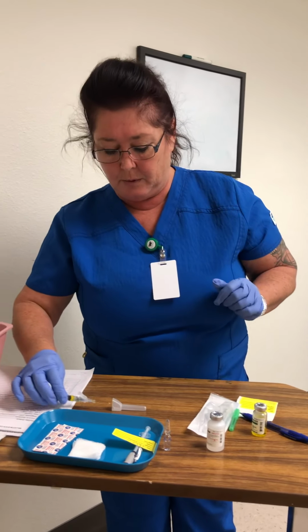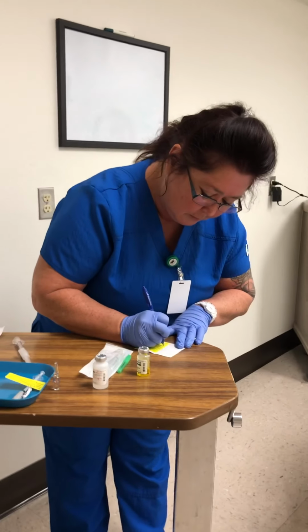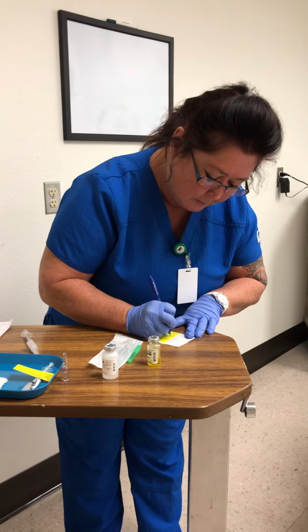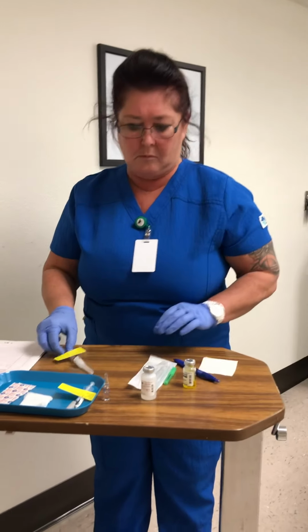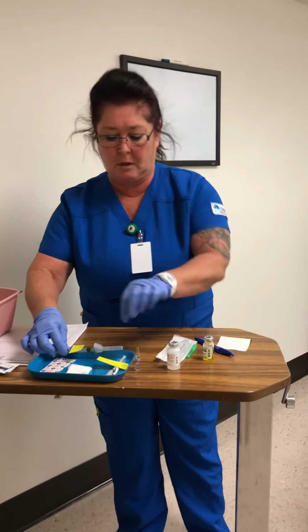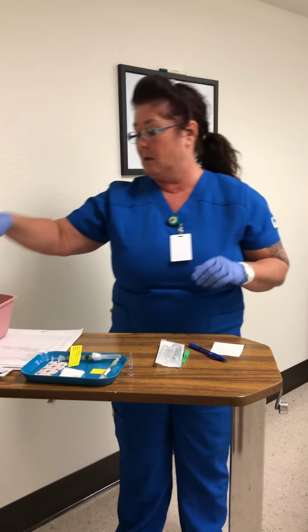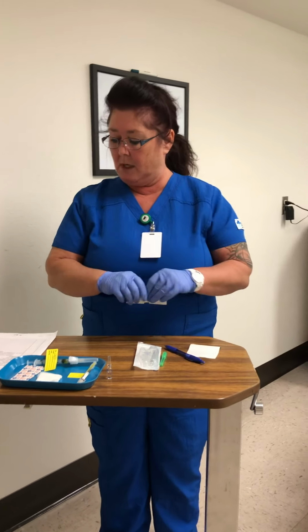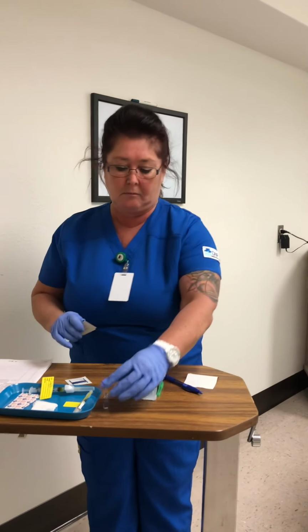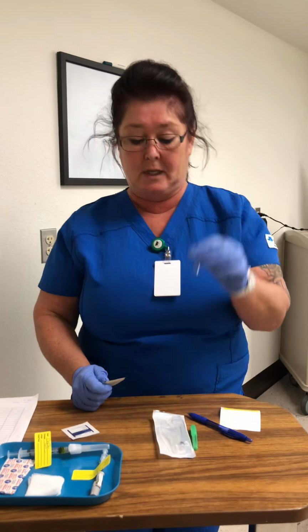I am going to recap. And I am going to label. And place this on my tray. And I would dispose of these in the proper way. And last but not least, I'm going to be doing my 25 milligrams of Phenergan. And again, I have done my dimensional analysis, knowing that I only need to pull 0.5 mils out of this.